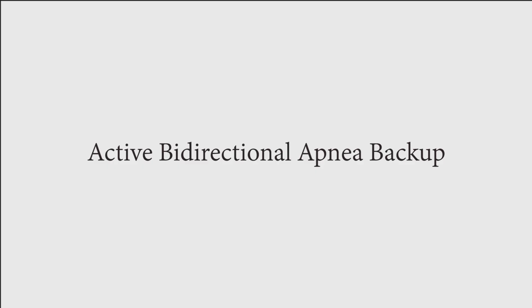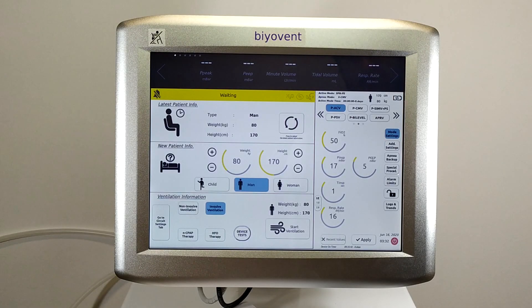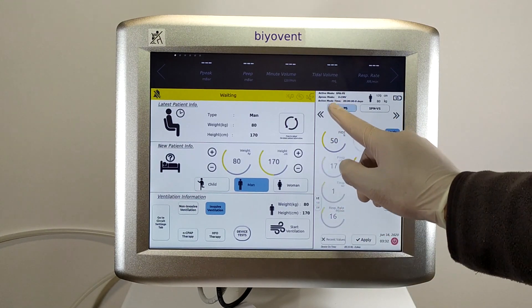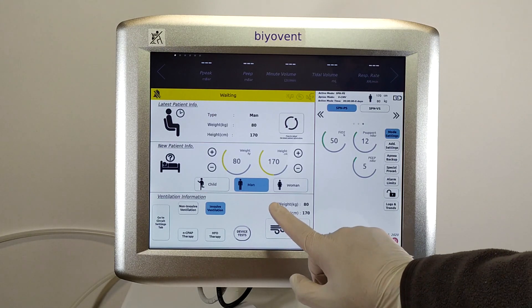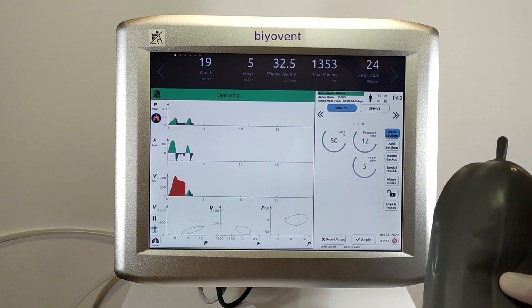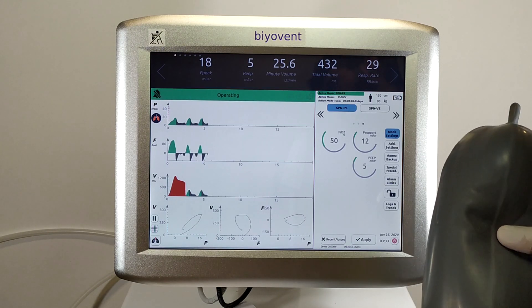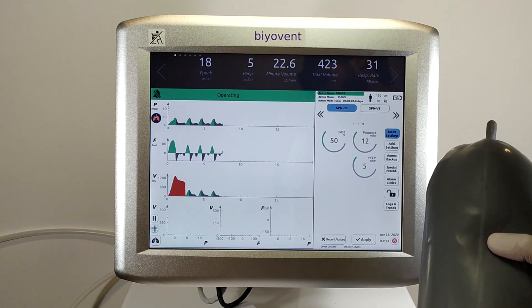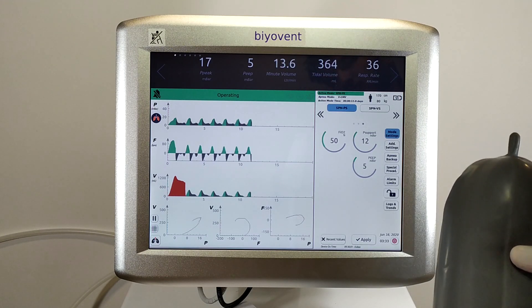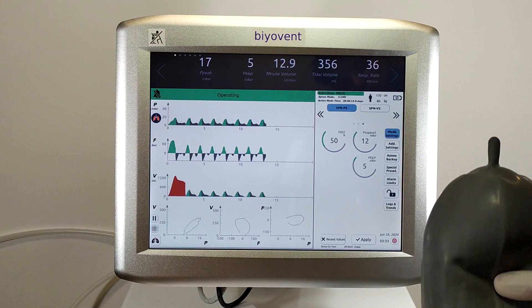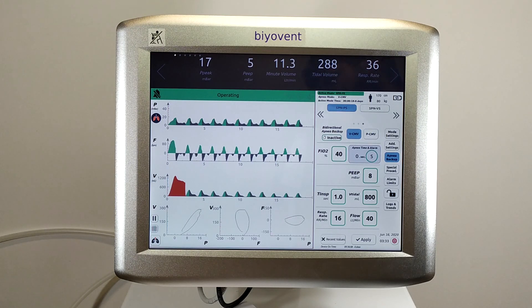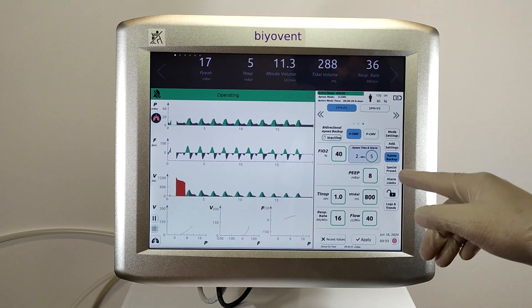Now let's simulate with the active bidirectional feature. After all settings, let's choose pressure control spontaneous mode from the mode settings, then start ventilation. I simulate the patient's breathing with my hand. As you can see, with the patient triggering, the Biyovent works normally. When you touch the apnea backup button, you can see the apnea settings which you have already set.